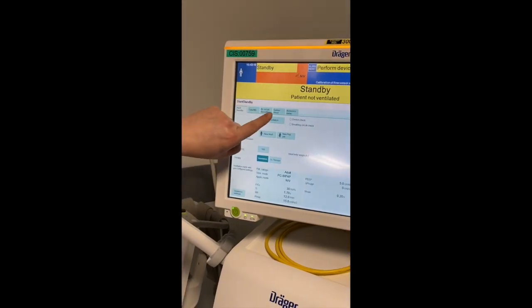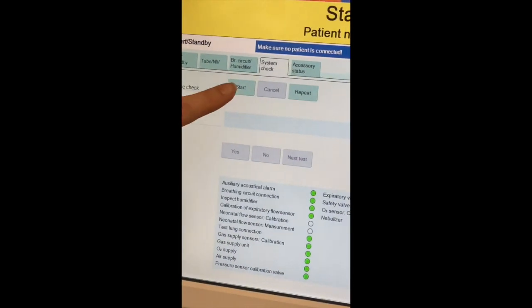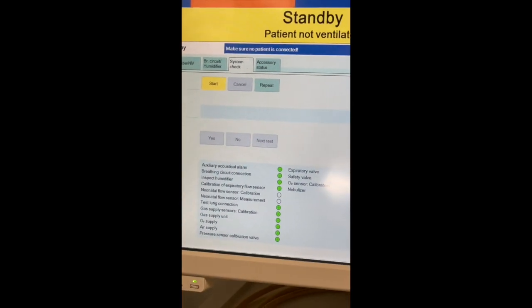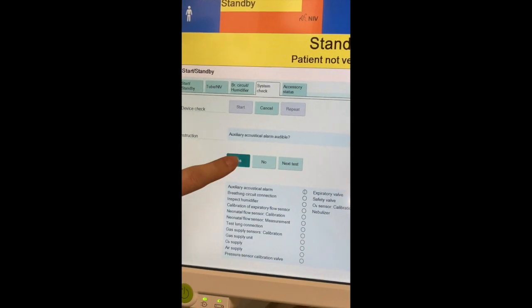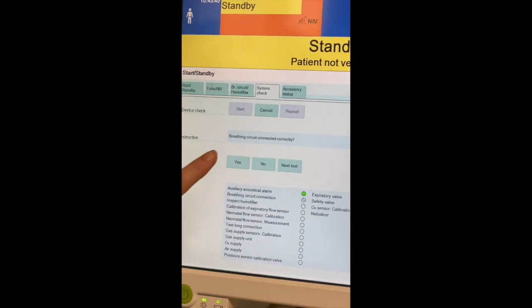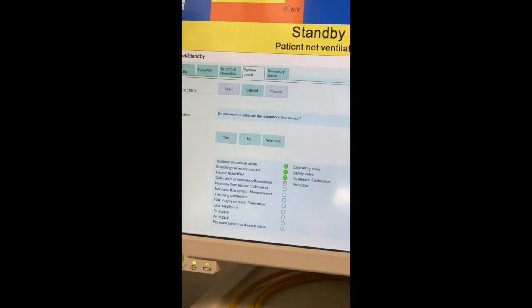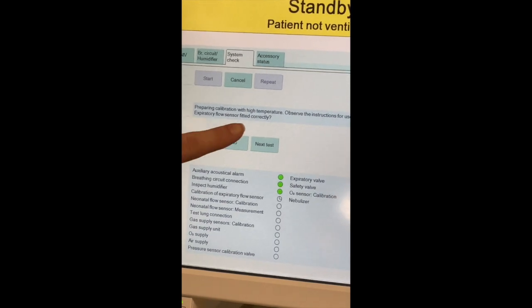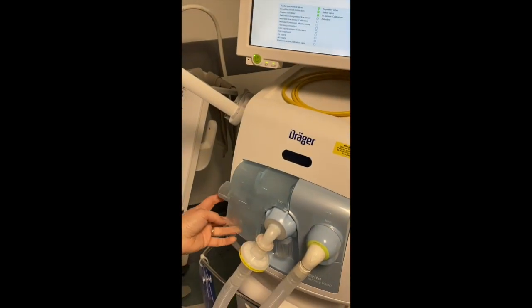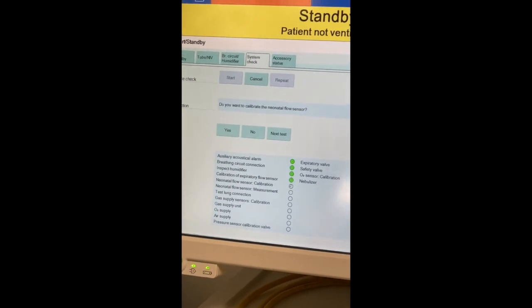To perform the check, press the system check tab on the top, then the device check tab on the side, then press start. It will go through a series of instructions — confirm each by pressing the rotary knob. It will ask: Is the alarm audible? Are the breathing hoses connected correctly and fitting nicely? Is the humidifier connected correctly or not used? Do you want to calibrate the expiratory flow sensors? Is the expiratory flow sensor fitted correctly — push it into the expiratory valve. Do you want to calibrate the neonatal flow sensors? No, because we're not using it for neonates.